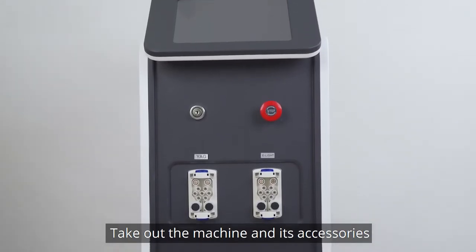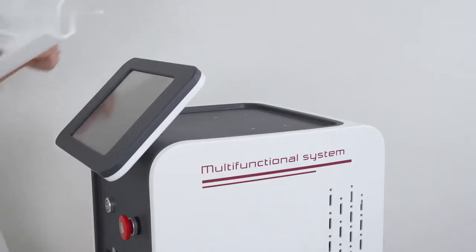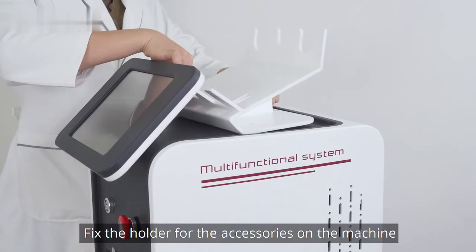Take out the machine and its accessories. Fix the holder for the accessories on the machine.